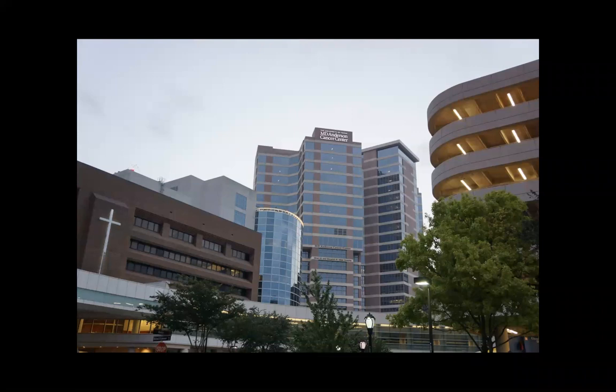Without an optimal bowel preparation, with a BBPS 8 or 9, ideally 9, the additional value of indigo carmine dye-based chromoendoscopy is 0.